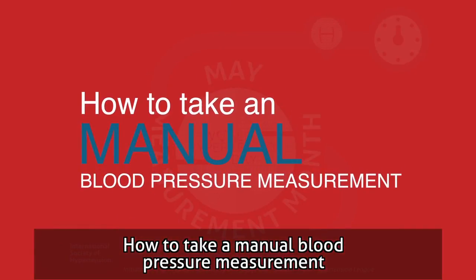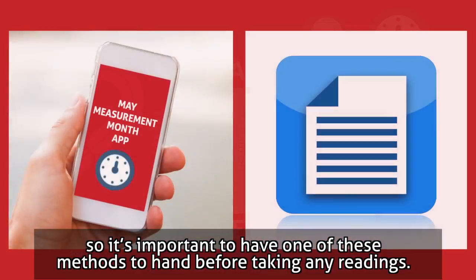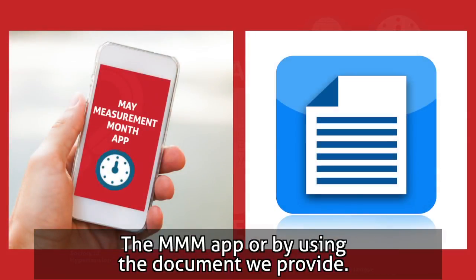How to take a manual blood pressure measurement. There are two ways to record the measurements you take, so it's important to have one of these methods to hand before taking any readings: the MMM app, or by using the document we provide.